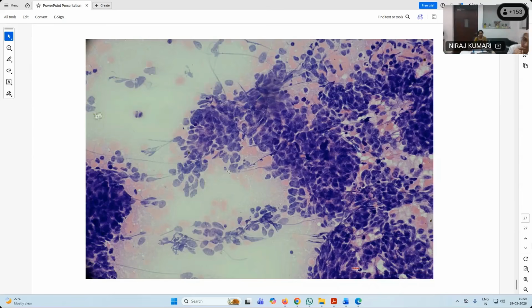Any small cell neuroendocrine cancers in head and neck? From the nasal region? Nasopharyngeal again, not exactly like this. It will be more dispersed with prominent nucleoli, and then you will see some lymphocytes admixed with that. But you do have small cell neuroendocrine carcinomas in the nasopharynx. Yes. So this metastasis can come from there.